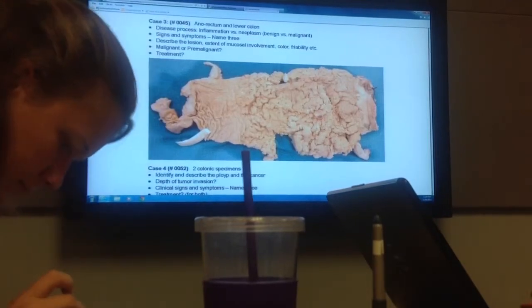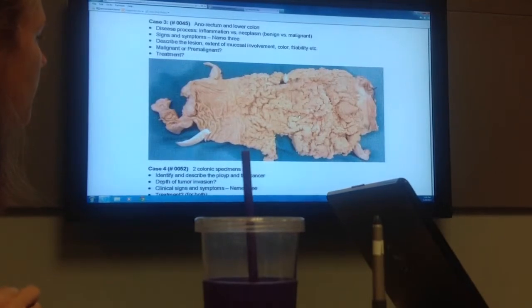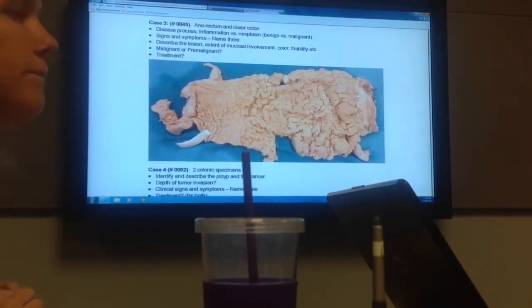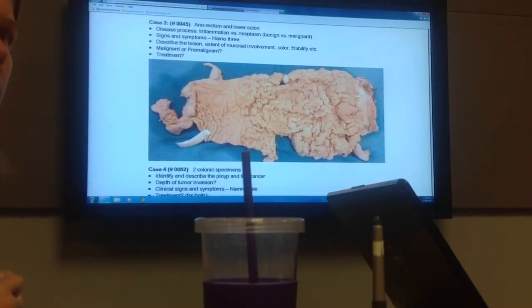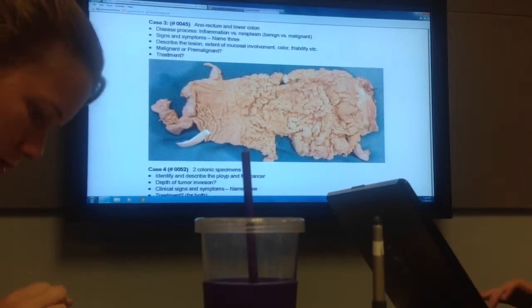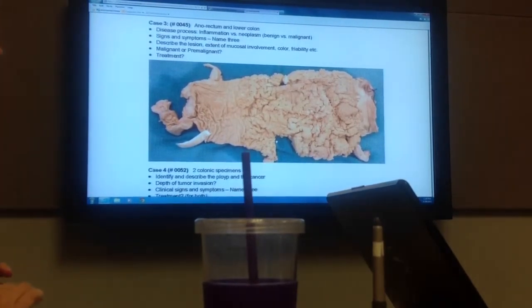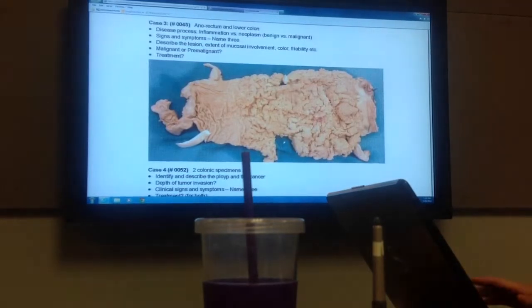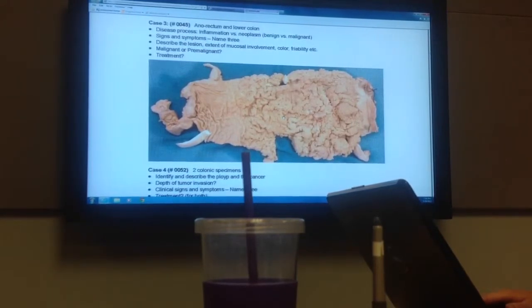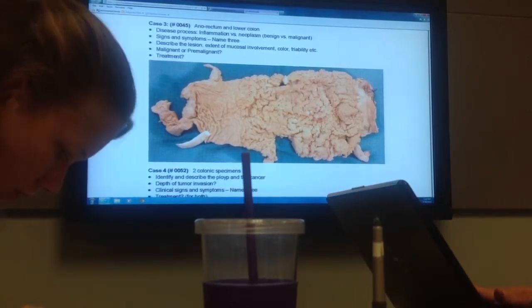If you remember when you split something like this, when you fold it up, the diameter is compromised by however thick this is. So what kind of symptoms maybe did this patient have? Obstruction? They could have been obstructed or partially obstructed because look how thick this is. When you roll it together, it's going to leave a very small lumen, okay? When you have a small lumen, that's when people have, what do they call them, small caliber stool, things like that.